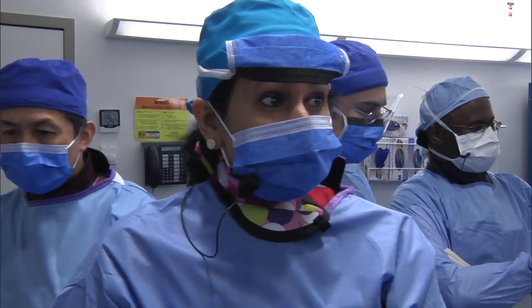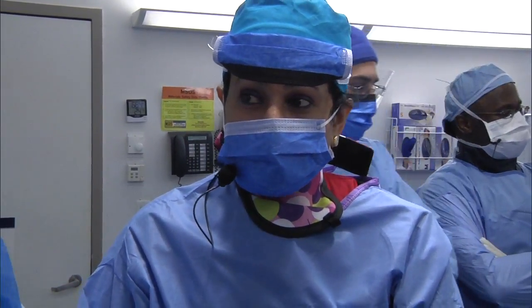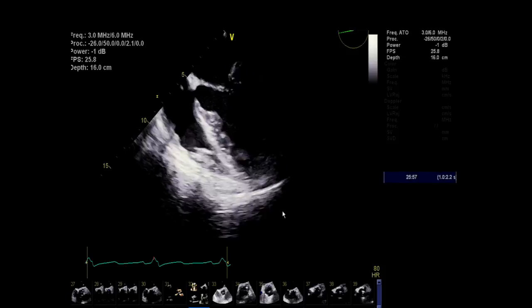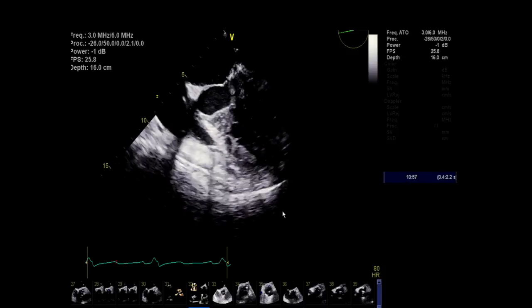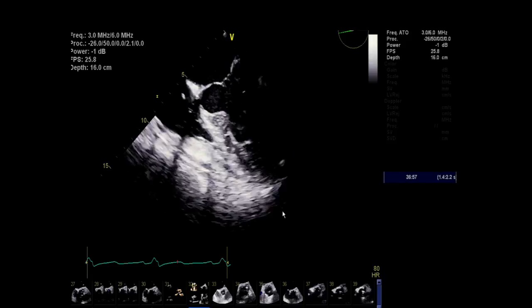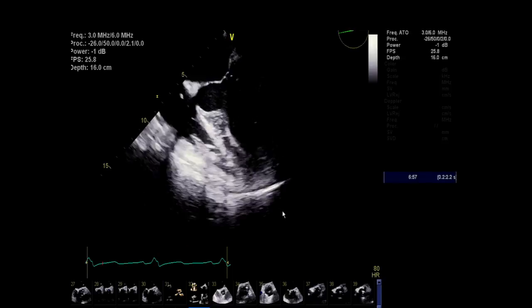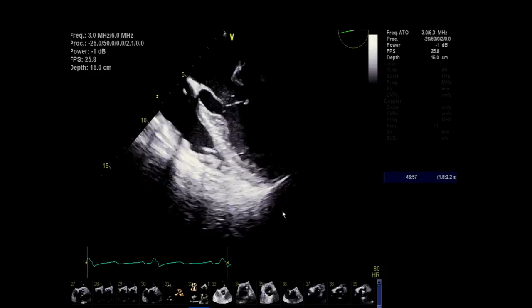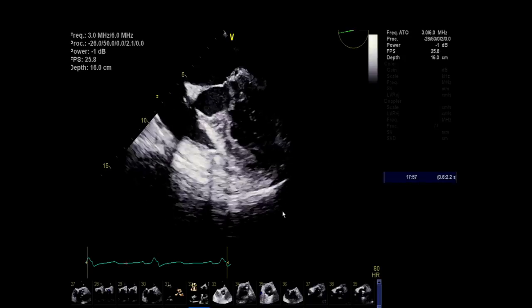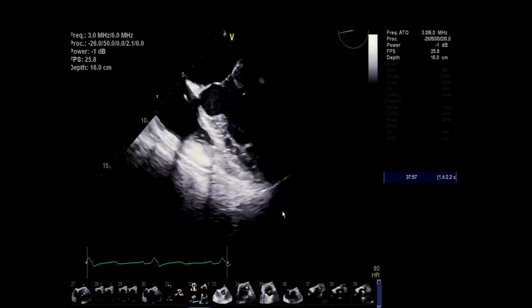Normally we would have pre-dilated with a 22 balloon, but since he's telling us that it's a unicommissural valve, we have to make sure that the commissure is completely opened, or we actually have to split open the rest of the C-shaped area which does not have a commissure. We decided we will go with a larger, 23 millimeter balloon and be very generous when doing the BAV. Going back to Alan's question, where are we going to place the valve? In this particular case, we will have to go slightly lower than what we normally would, since there is a single commissure. Once it is split, we want to make sure the valve just stays there. If we are at a normal place, it may just push the valve higher up. That's what we predict, so we will go for a lower valve implantation.